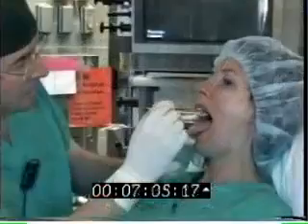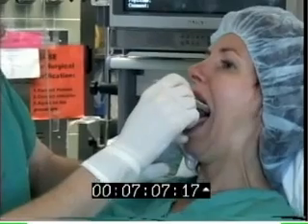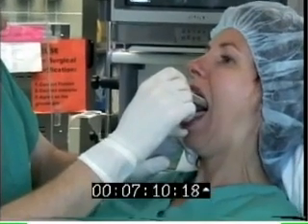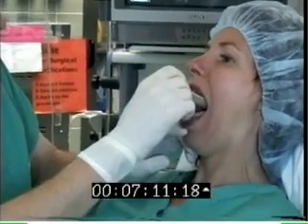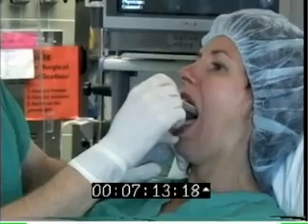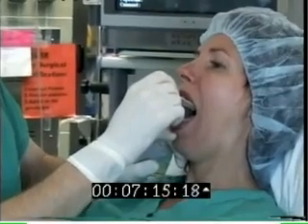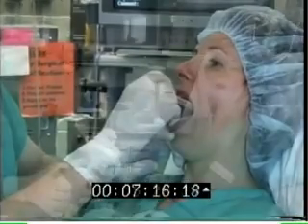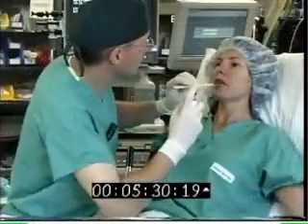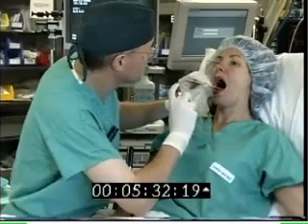If the patient cannot gargle, an alternate topical anesthetic technique should be employed by either applying 5% lidocaine ointment to the back of the tongue with a tongue depressor, or using a 10% lidocaine spray directed to the relevant structures.